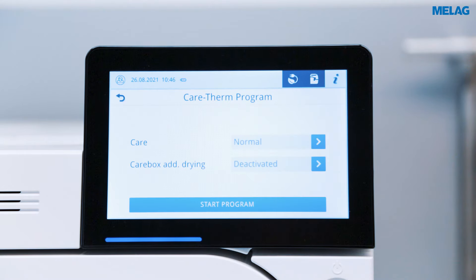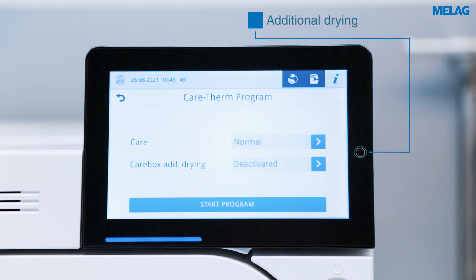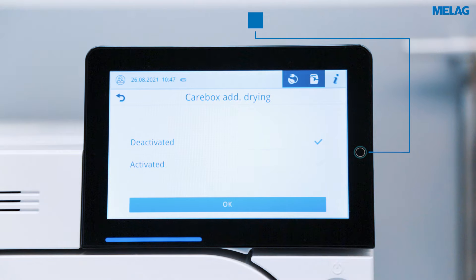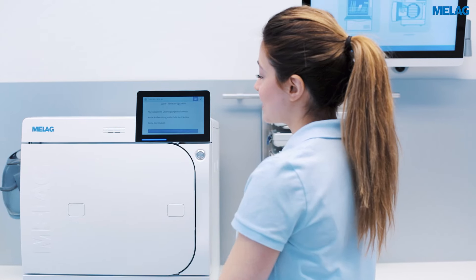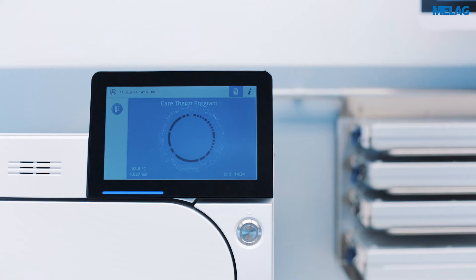Depending on the programme, you can make adjustments such as setting the intensity of the care process or activating the additional drying function. Then simply start the programme with your desired settings.